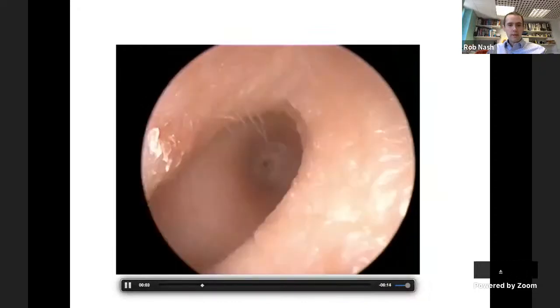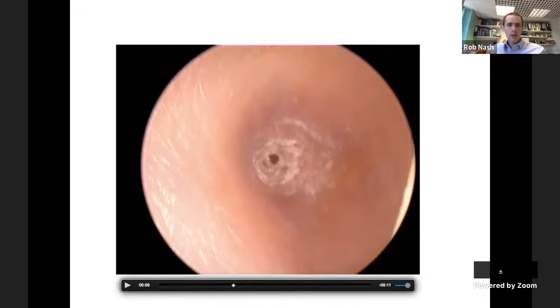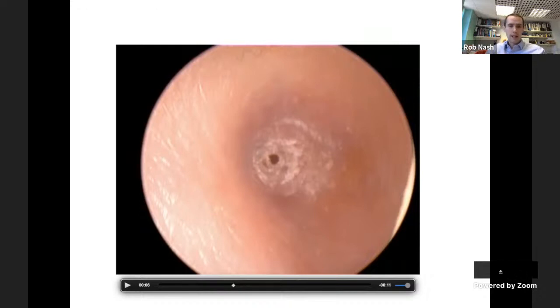With an ear like this, you can't see the eardrum at all. What you see is far too lateral and doesn't have the characteristic findings of the eardrum in terms of angulation and skin quality. This is an inflammatory stenosis of the lateral ear canal. You can see it doesn't necessarily involve the medial part because there's a puncture there with at least some aeration, so it's narrower laterally than immediately medial - but this condition is often associated with stenosis arising from the medial part.